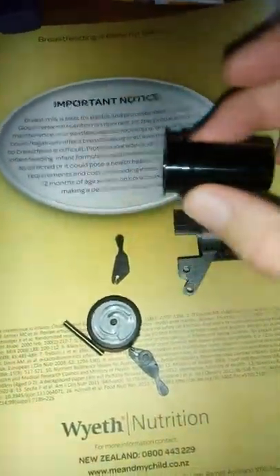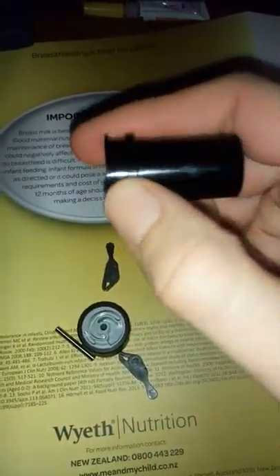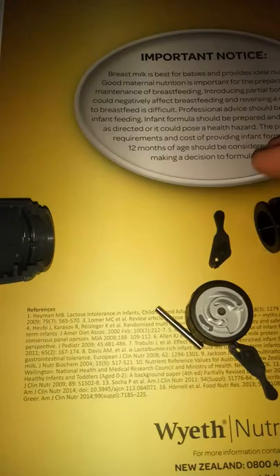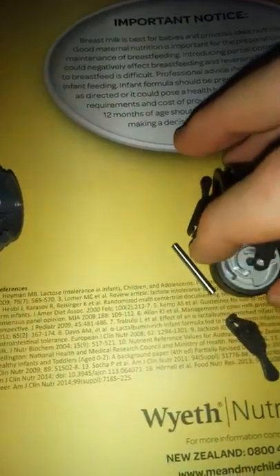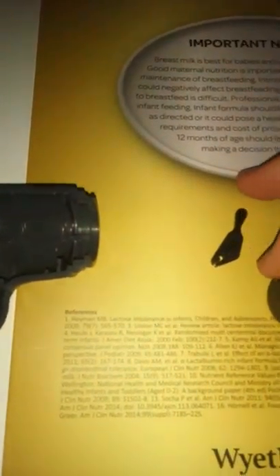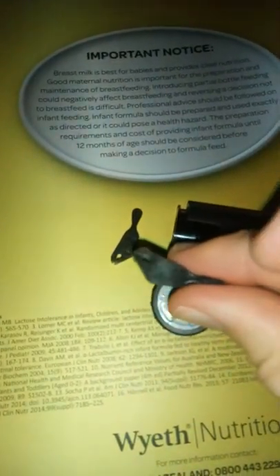So this is the housing. This is the movable lens that focuses. So there's the lens at that end, and then hole, and this groove. You see that groove there, is where these little arms hold in. So that goes in there, facing this way. Then the control wheel goes right there, and you put the axle through it.